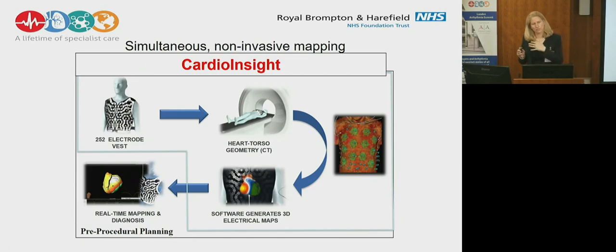locate the surface ECG electrodes and then have the 3D reconstruction from either the ventricles or the atria for the CardioInsight system. And then you basically can follow this patient. You can monitor this patient for, I think, up to 8 hours by now on the ward, for example. Yeah, or even in an outpatient clinic setting, and see what the patient produces.